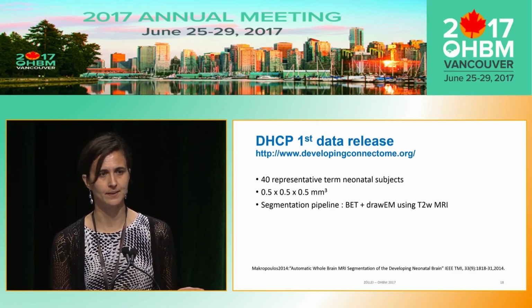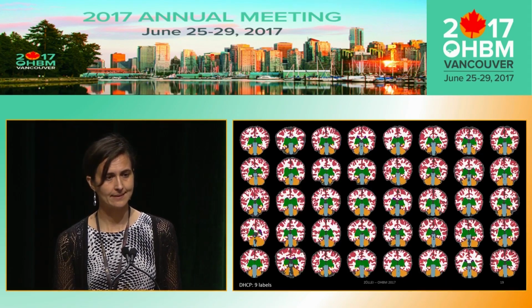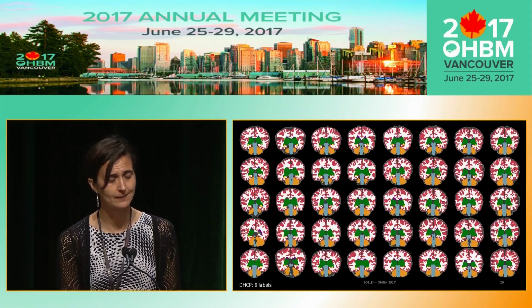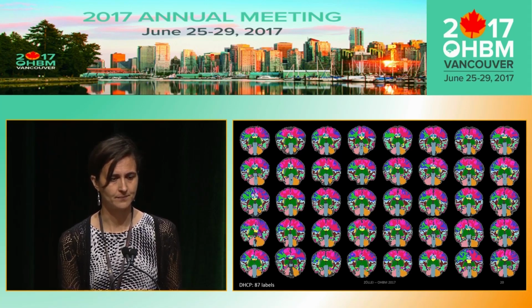The segmentation pipeline included BET for skull stripping and DrawEM on the T2-weighted images. These are the segmentation labels that were released. This is the 9-label segmentation, where there are no distinctions between left and right hemisphere labels, and the 87-label segmentation.